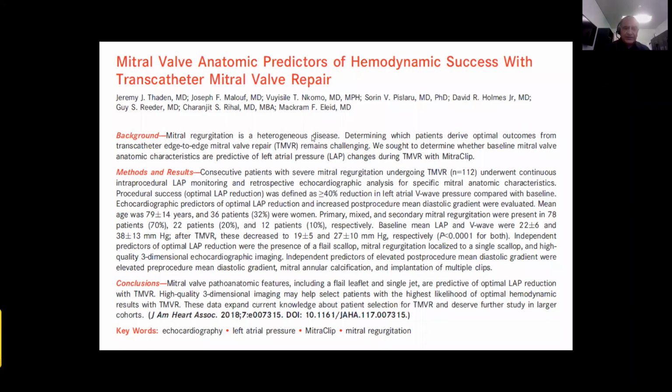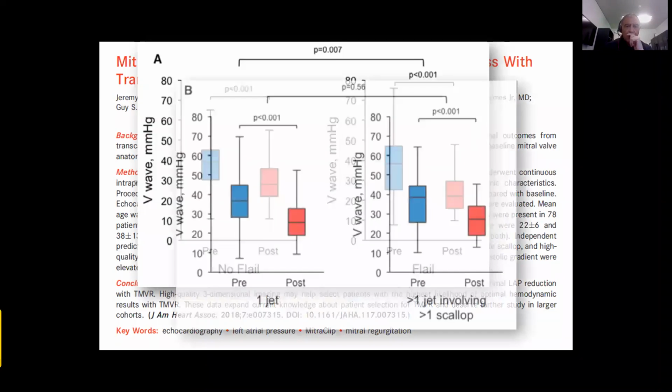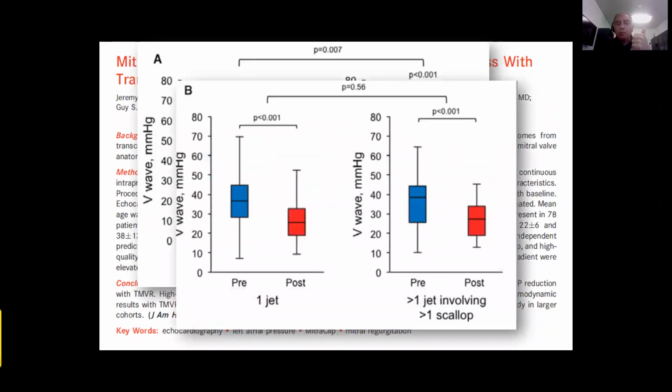into the left atrium. And what they found was that if there is no flail, the V wave could be reduced, but it is much more reduced if you have a flail. This is not surprising, because if you have a flail, you just clip in the position of the flail, and usually you succeed. Or if you have just one jet or more than one jet involving more scallops.